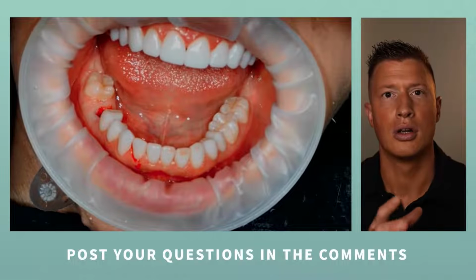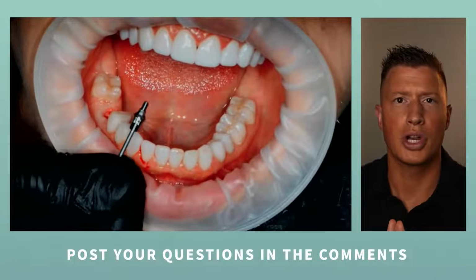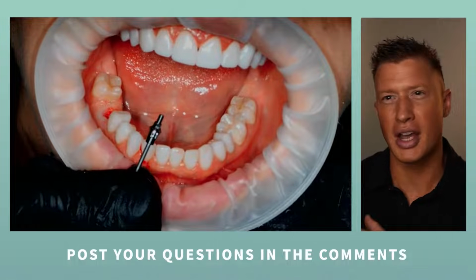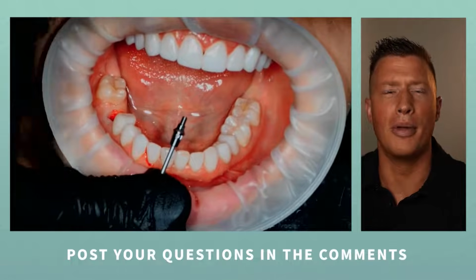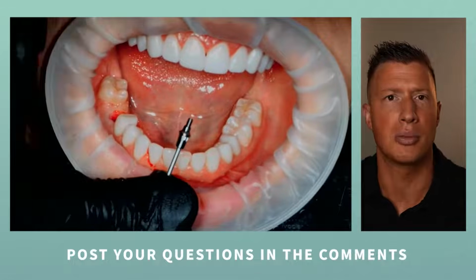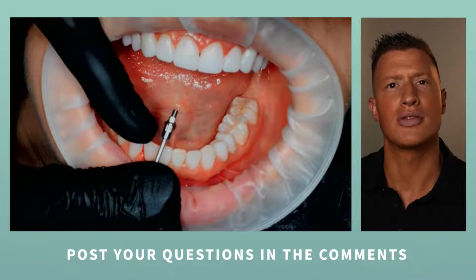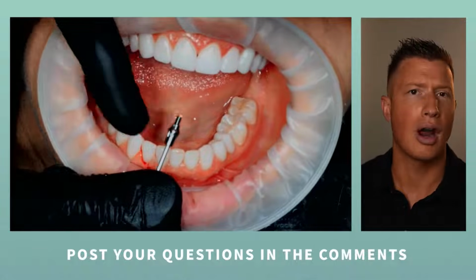idealize your future crown. I kind of use the example or analogy that when you're going to build a home, you don't design the foundation and then the home, right? We design the home and then the foundation has to help support the home. And really with dental implants, we've always done it in reverse in the past, right? We place the implant and then we figure out how to put a crown on it.